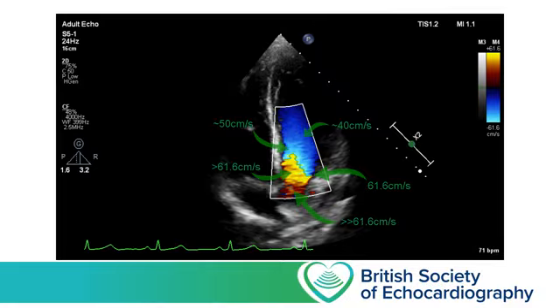As the blood is funneled into the left ventricular outflow tract, it has a smaller and smaller area to pass through, and so to get that same volume of blood to keep moving, it has to accelerate. And now we can see that in this very next frame, the dark blue has given way to brighter blue, which represents faster moving blood. And then this bright blue area suddenly flips into a bright yellow.